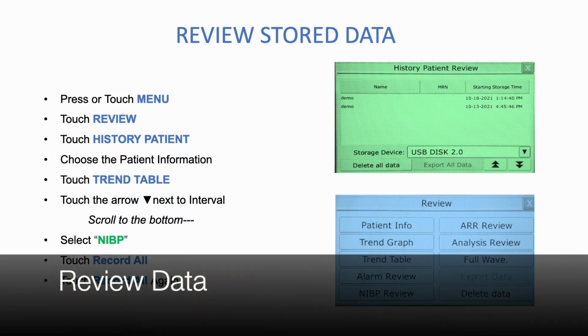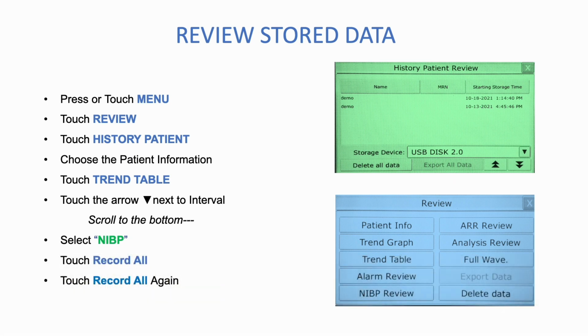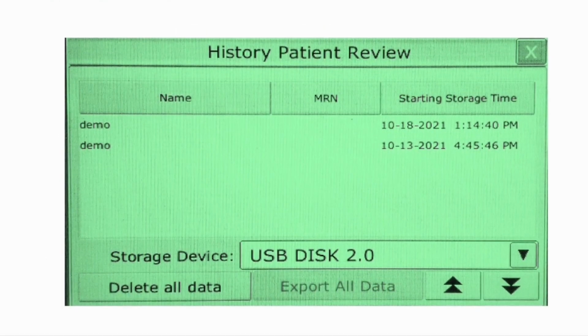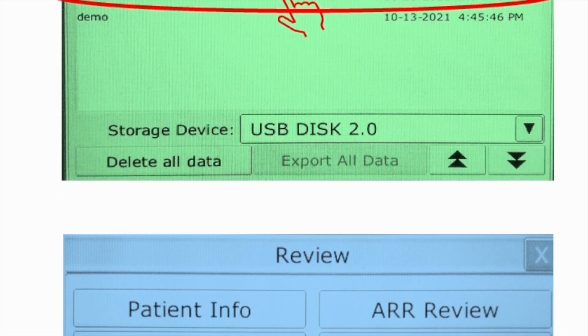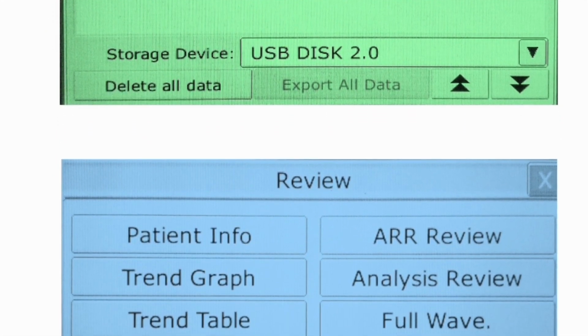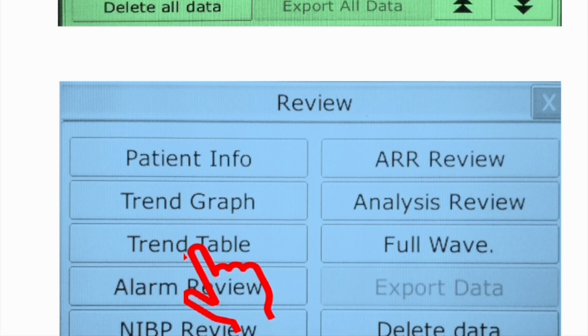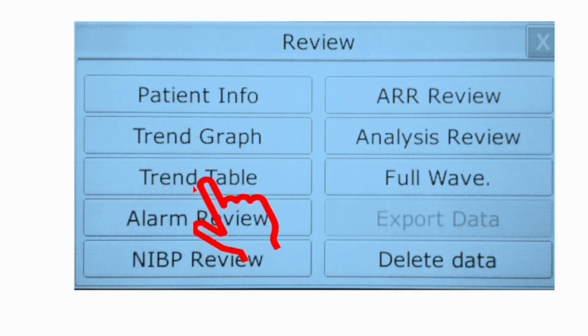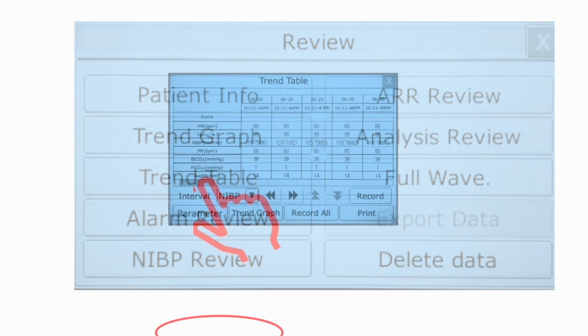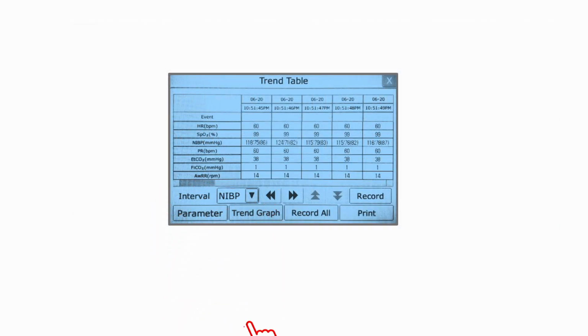To review the data stored on the USB or in the internal memory, press or touch Menu, touch Review, touch History Patient. Choose the patient information that you wish to review. While there are several options to choose from on the Review menu, the concise option is Trend Table. This will allow you to view and/or print all of the parameter data. Choose Trend Table, touch the arrow to the right of interval and scroll to the bottom. Select NIBP, touch Record All again.